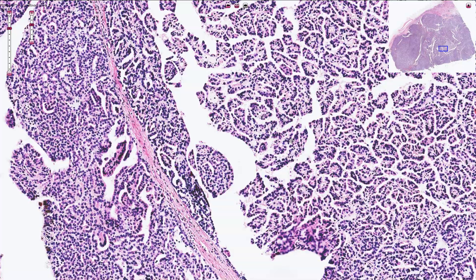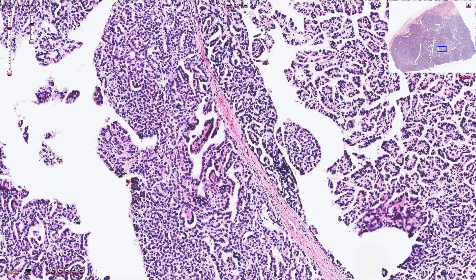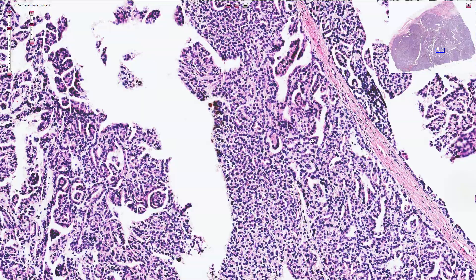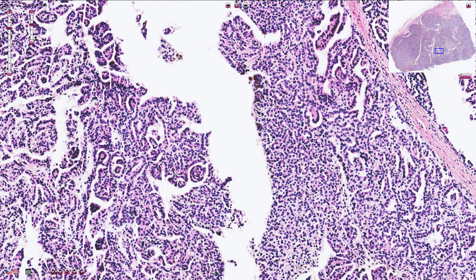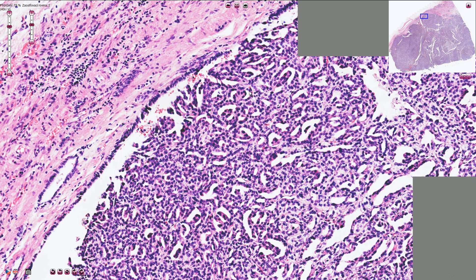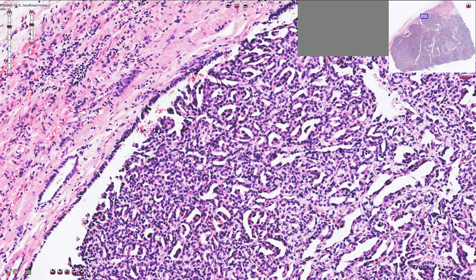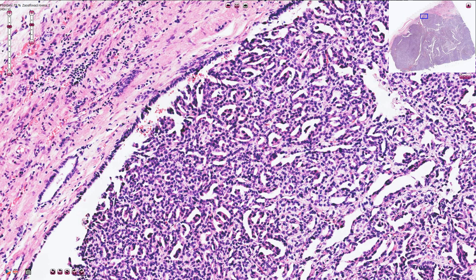It is not uncommon to see other types of growth. Here we have an example of glomeruloid structures that resemble normal renal corpuscles. Here we have a small area of solid growth, and here we have an example of tubular or acinar type of growth with a few foci that slightly resemble small glomerular structures.